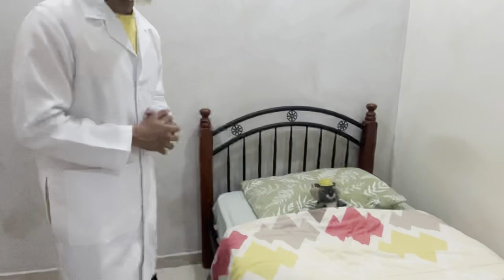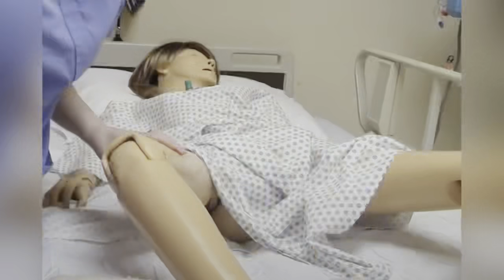After you have prepared the equipment, you need to make sure that the patient is in position. Tell the patient to lie down on their back, in supine position, and make sure that you place a drape behind the patient. This is to protect the bed from any urine that comes out. You also must make sure that the patient's legs are open. In this picture, the knees are bent and the hips are open.